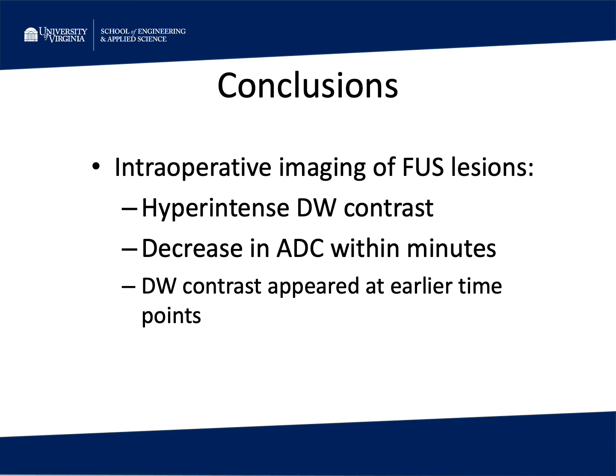In conclusion, our study found that when intraoperatively monitoring focused ultrasound thermal ablations, lesions presented hyperintense diffusion-weighted contrast, that the apparent diffusion coefficient of the lesions decreased within a few minutes after reaching the target temperature, and that diffusion-weighted contrast could be found to emerge at earlier time points relative to T2-weighted contrast.